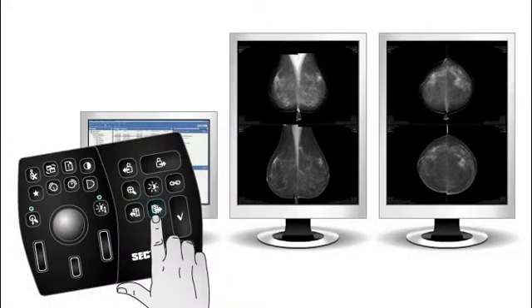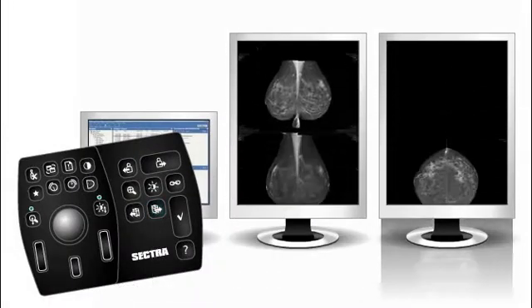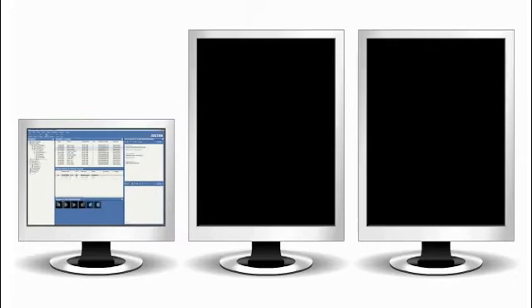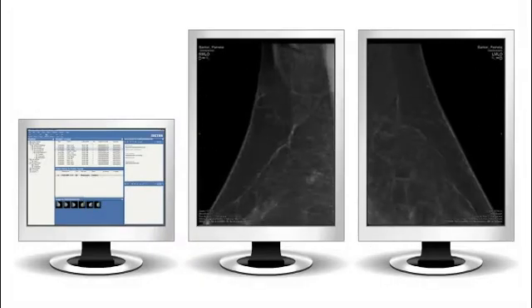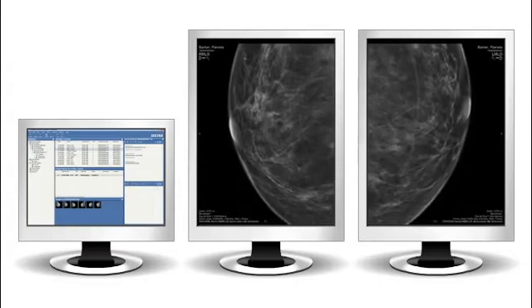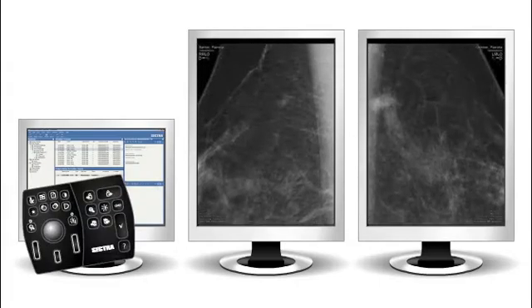By simply pressing Next Hanging on the ergonomic keypad, you will quickly and easily work your way through the case. Normal reads are reported with a single keystroke, and the next case is then automatically selected. You can easily zoom and pan your images, even in sync. You can also program your most commonly used tools to be launched with a single keystroke.